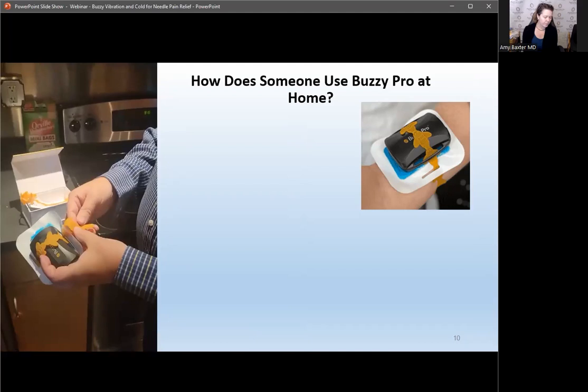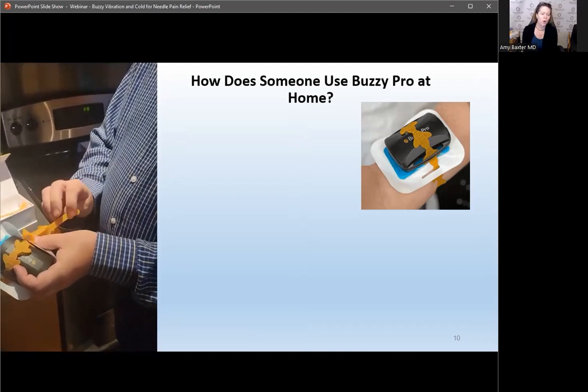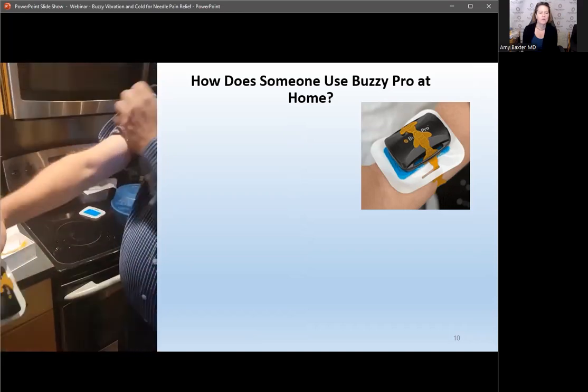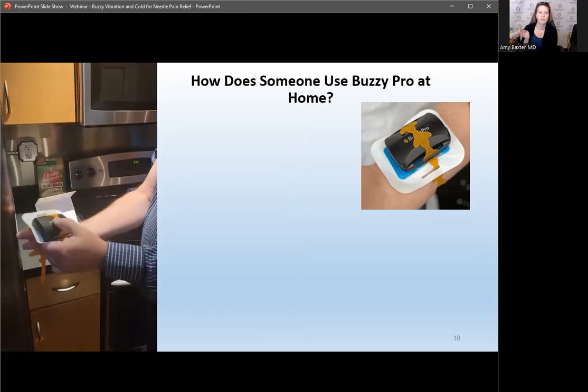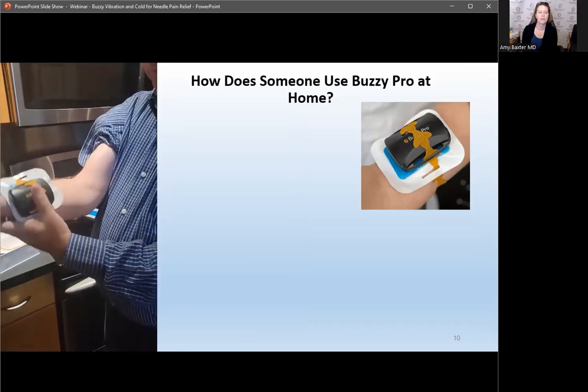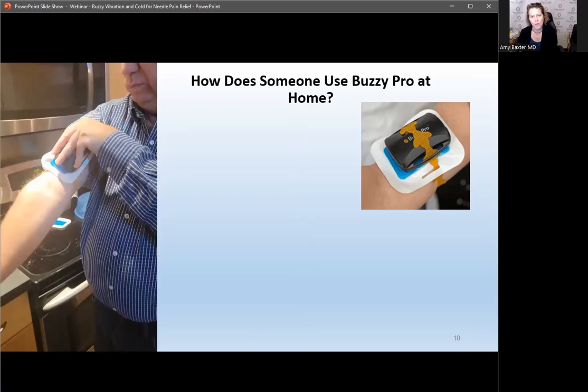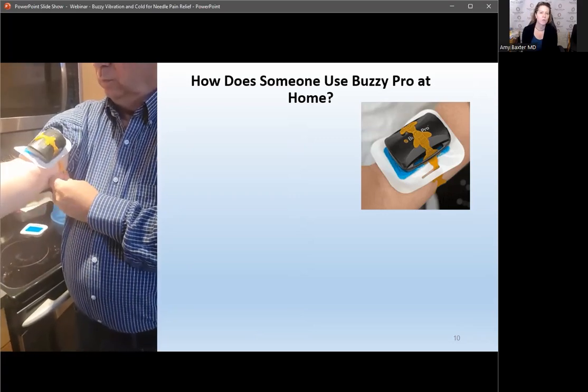So then it goes through the hole that's in the end of the strap. And while holding the end of the hole, the person is going to put their arm through like such, and then they can cinch it tight. So in this way, someone is able to put on a tourniquet one-handed.